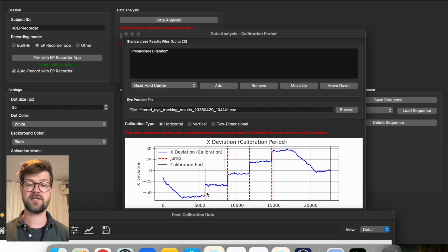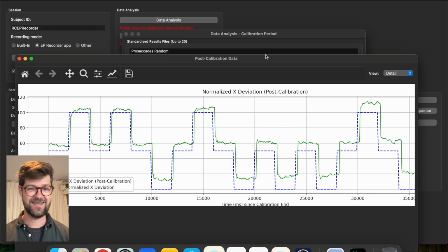the correct points. So we should see from that calibration, so we had the eye moving in a pursuit from the center down to over to the left, and then saccading 4 times over to the right. Those 4 saccades is what the program uses for calibration. So we should see these nice red dotted lines going through the jumps in the graph here. If not, we can use the manual calibration. This one's worked well, so we don't need to do that.